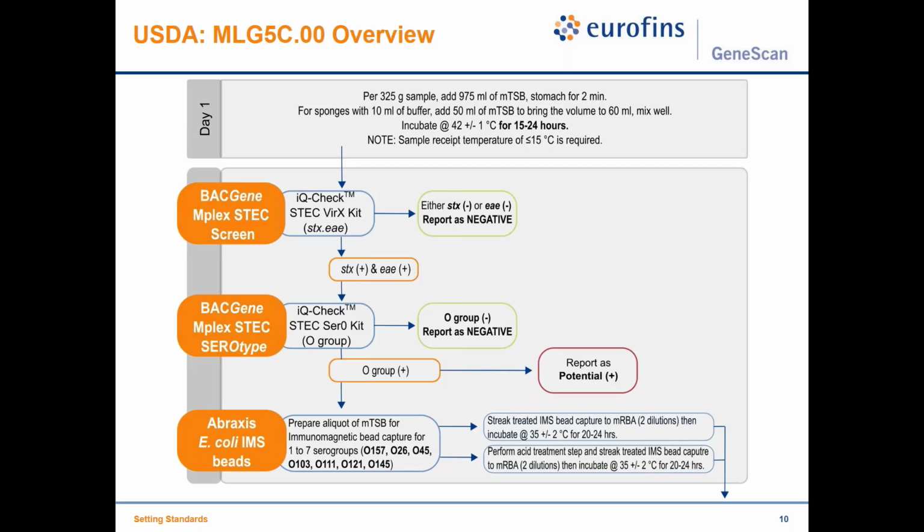then you will go into a serotyping. You will run more assays defining which serogroup is in that. If you don't have any of the relevant ones, you would also call it negative. So this is the difference to Europe. In Europe, of course, you would say stx positive, and then you have a presumptive straight away. So after this, then you will go into isolation. I think most people probably don't do the isolation, but then send it off to expert labs.